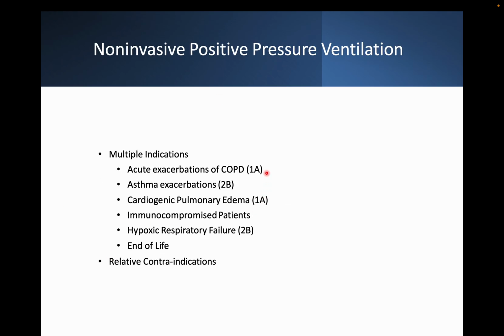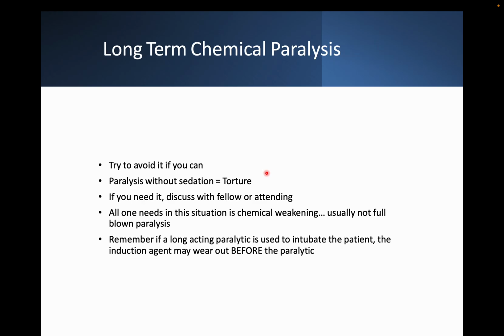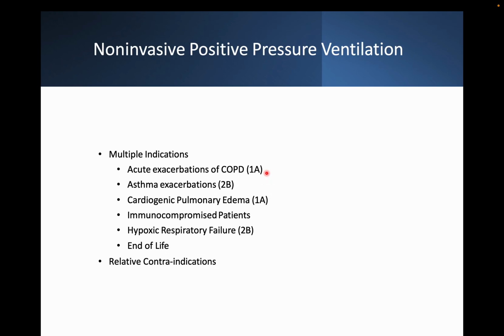So what are the records? This is all regarding invasive ventilation. We discussed tidal volume, respiratory rate, the I by E ratio, and the flow rate. Previously we also discussed sedation. Now we discuss non-invasive ventilation.